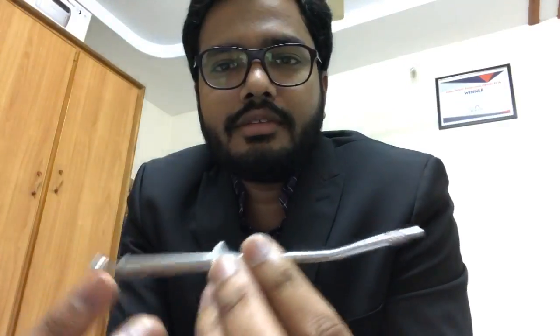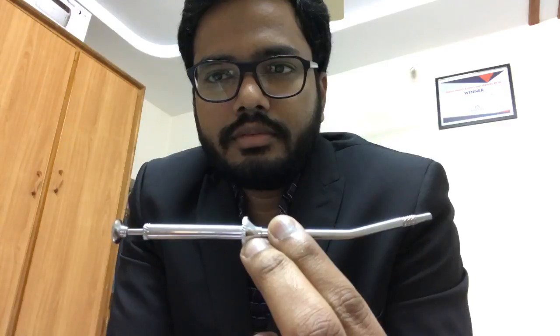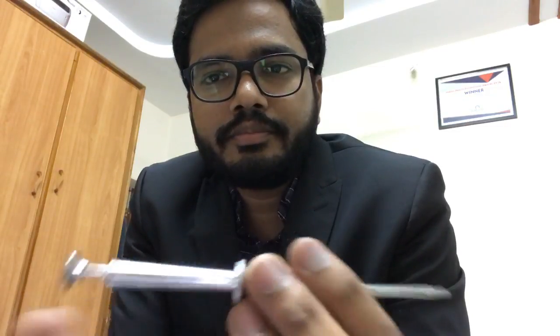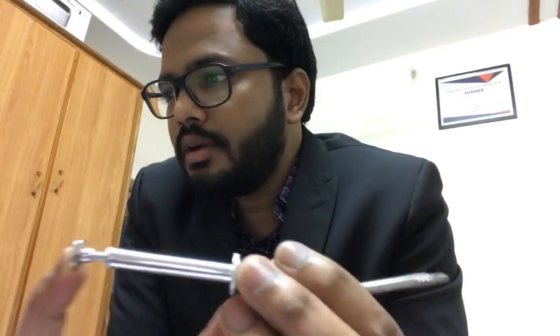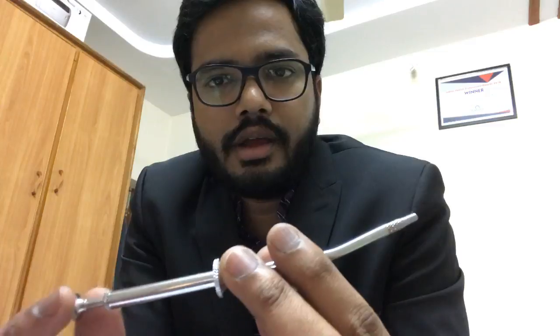So this, it should be easy for you to identify. We have a piston here. We have a hollower part in order to carry amalgam. So this is an amalgam carrier, right? So that's obviously understood. Yeah, cool. So it helps in carrying amalgam and also helps in simultaneously condensing amalgam in the cavity. We use a condenser, but in order to retain the amalgam in a cavity, we can place it and condense it simultaneously.